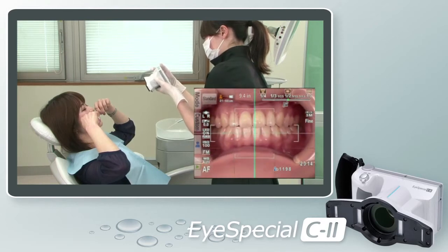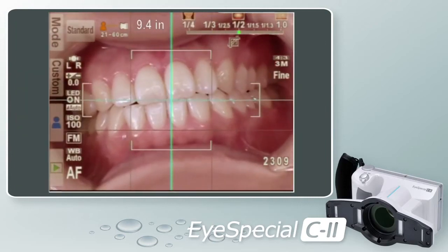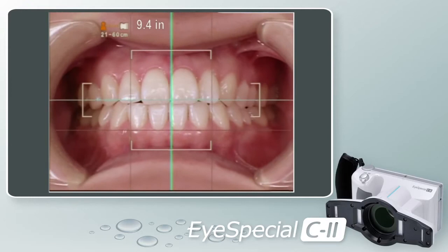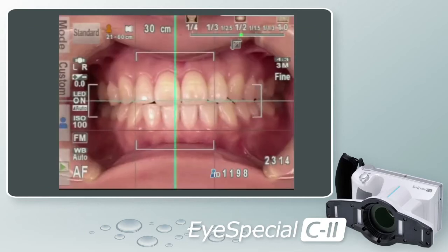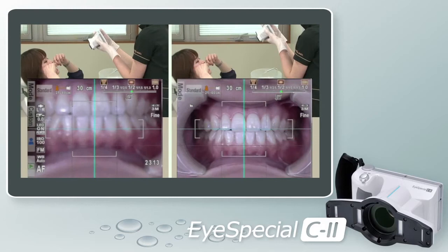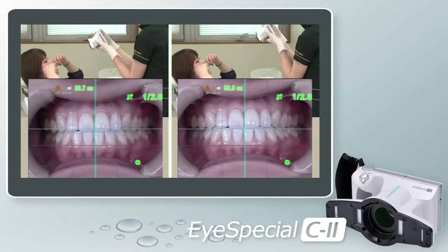Notice the dental grid lines that appear on the screen — these are there to help you line up the midline or occlusal plane. When taking a retracted smile, simply line up the midline with the center grid line, pull the camera back to the appropriate distance, and take your picture. Built into the iSpecial C2 is the half-press feature. When you half-press the shutter button, the grid lines, distance range, and magnification ratio light up green when your shot is in focus. If they appear red, let go of the shutter button, reposition the camera, and try again.